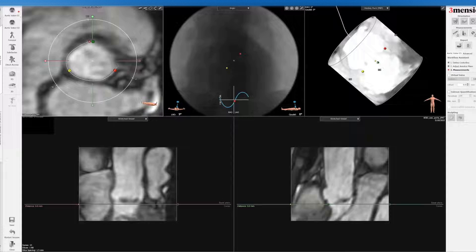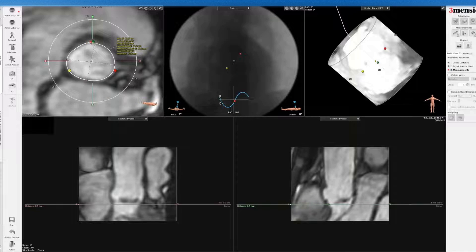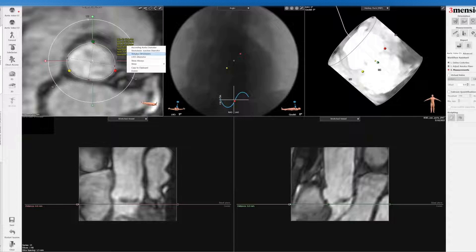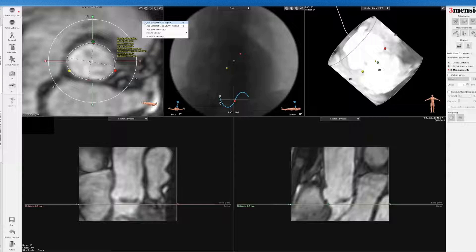Trace out the aortic annulus, and you can see that here. You want to be a little bit more conservative in your estimate because there is some artifact. So here's the annulus — I'm going to save it.